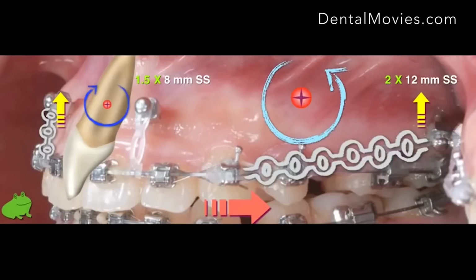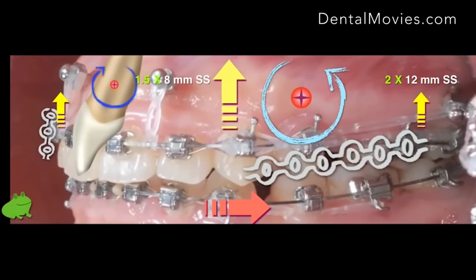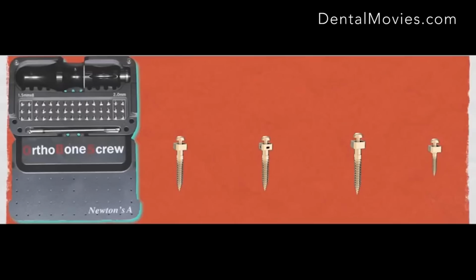This moment will have an intrusion force. So there are 2 intrusion forces put together, so you get a massive intrusion for the entire maxilla. And because we have a retraction, the maxilla also retracts a little bit. That's why we solve the convex profile and maxillary protrusion. So it will end up like this. That is the orthodontic mechanics to correct the gummy smile.